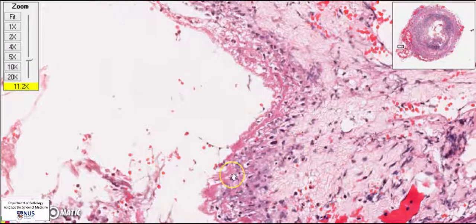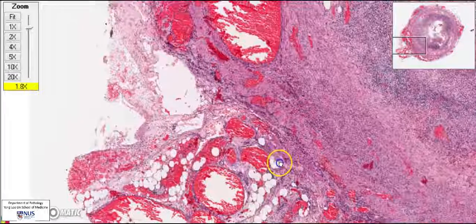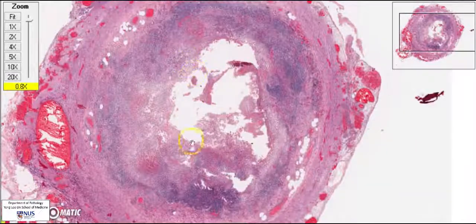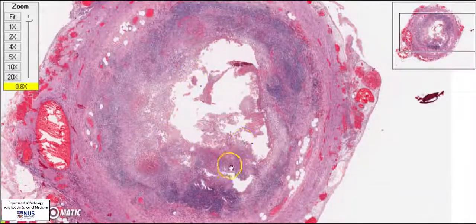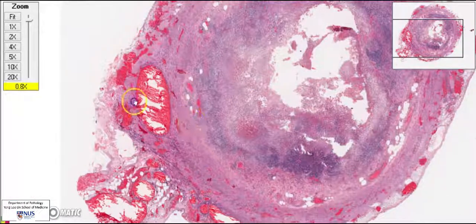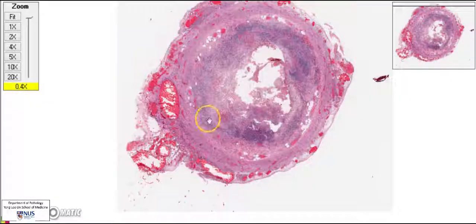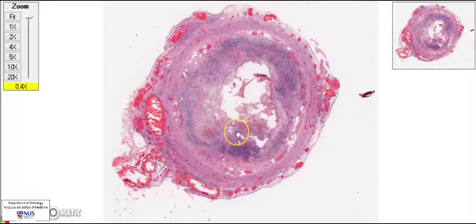This explains why, when you look at the appendix grossly, you can see a layer of purulent material — opaque yellowish material — just at the serosal surface. So to recap: we have extensive mucosal ulceration and necrosis, a severe transmural acute inflammatory infiltrate, and an accompanying acute serositis. All these features are compatible with acute appendicitis. Thank you.